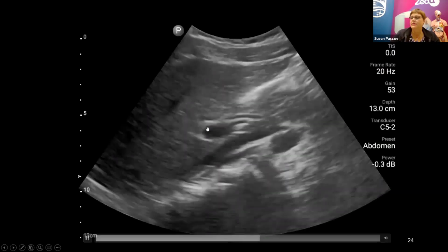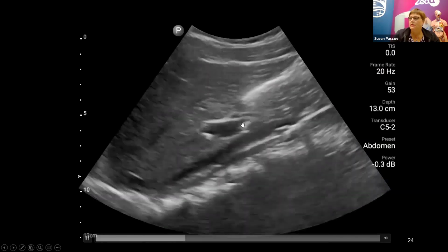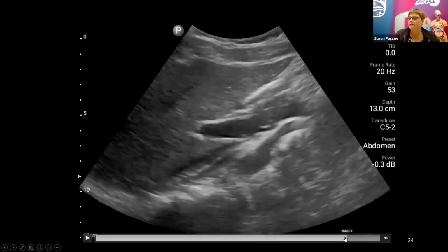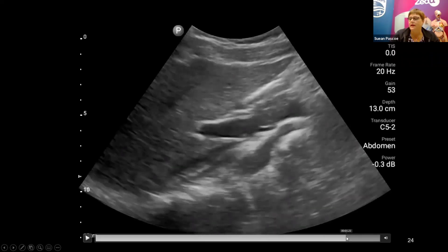Coming over again, we see where the portal vein comes out of the liver and the bile duct draping across the top. So this is where the cine loop button would be really good. We can come back a little bit. And that's all we do with the cine loop as well, is just try to find where we see the bile duct as good as possible.